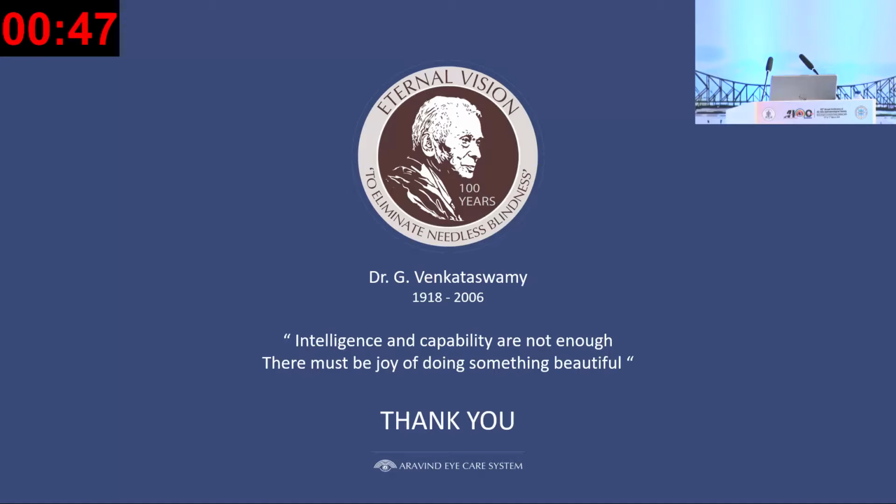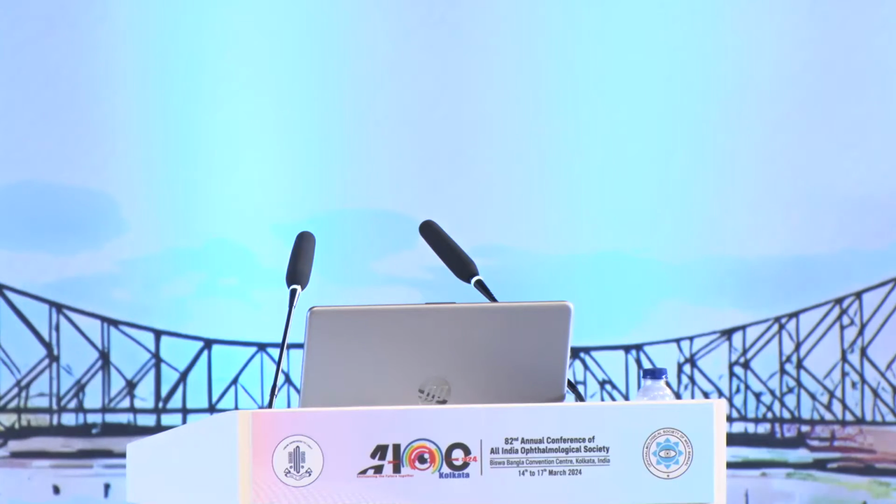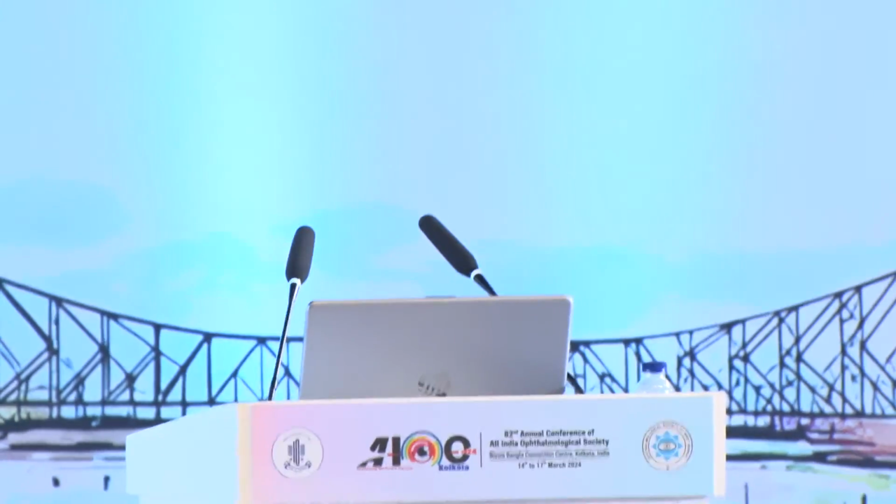Thank you. That was, I think, a lot of good tips on how to remove cortex, and Dr. Shivakumar clearly explained why it is so important to remove the cortex completely and not to be in a hurry. Once you have a PC rent, we think of the nucleus and then the IOL. We don't give as much importance to the vitreous and cortex, so it's important that removing this cortex completely is very critical in getting a good outcome. With that, we go on to the next talk on IOL placement in eyes with posterior capsule rupture. Can we have the slides on, please?